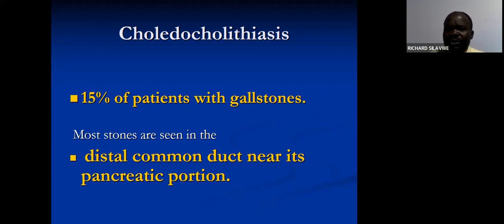It's very common to find renal stones, gallbladder stones, and also duct stones. I really don't know why it is like that. Maybe the weather here is very hot. Maybe people don't take a lot of water, such kind of a thing. So it's very common to see these stones or calculi in most of the patients that we scan here.